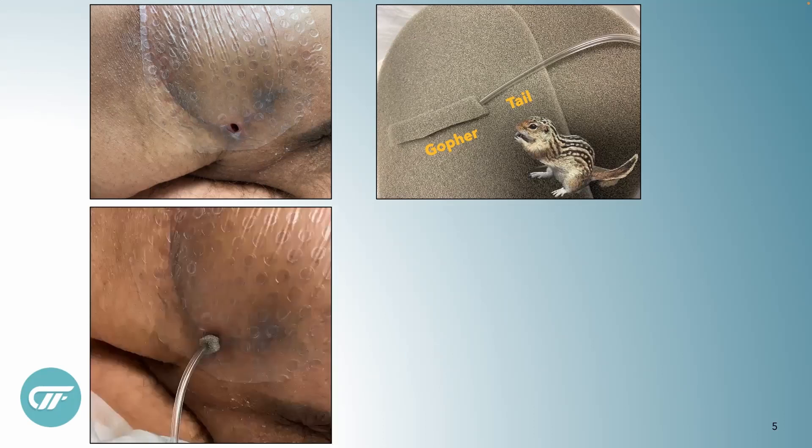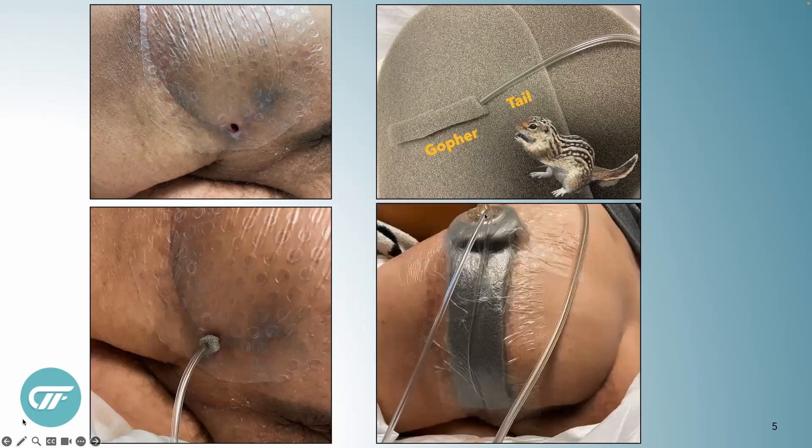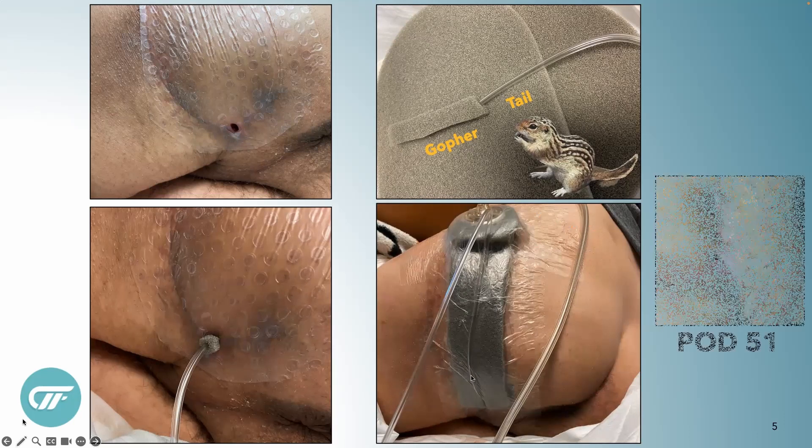This is what it looks like when it's deployed into the wound itself. You can see I'm using Dermatech drape, which is very comfortable for the patient, for my bridging drape. Then I just bridged him with a big piece of Veriflo dressing. The instill port comes down here and goes all the way into the hole, and then the negative pressure is up here on his hip. I like to run the instillation port right over the top of the bridge — it's a cushion for the tubing, but it's also safe for the patient. Then I usually put on a Meplex border dressing over the top of it.